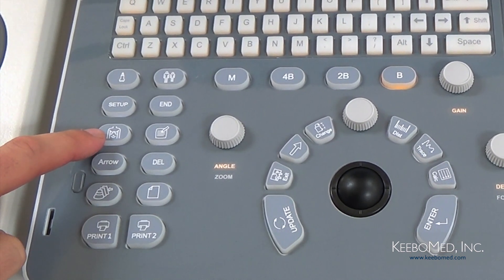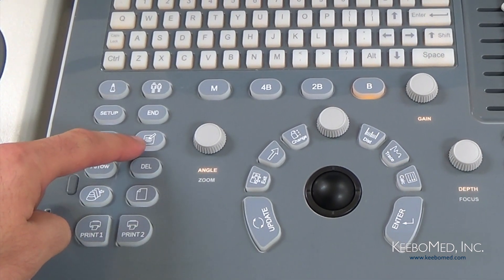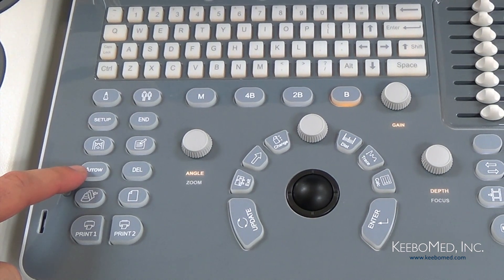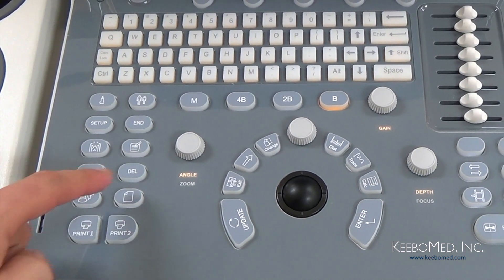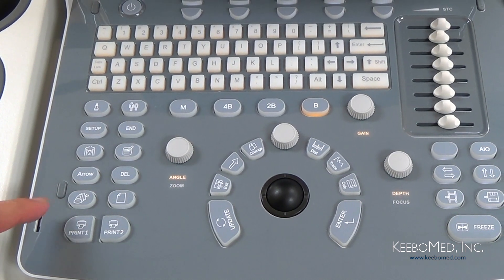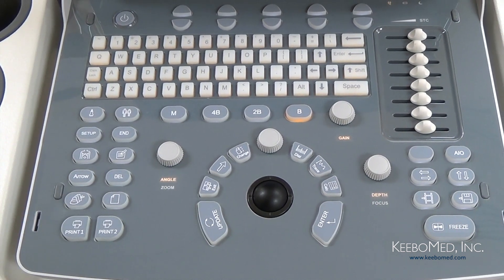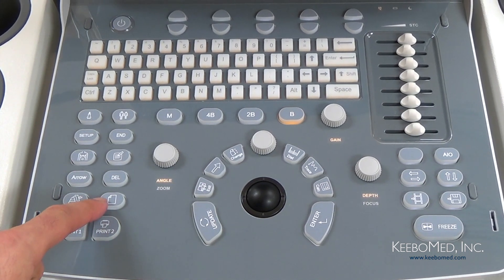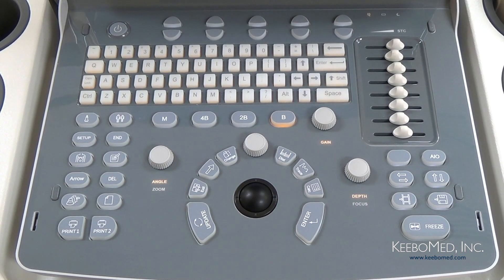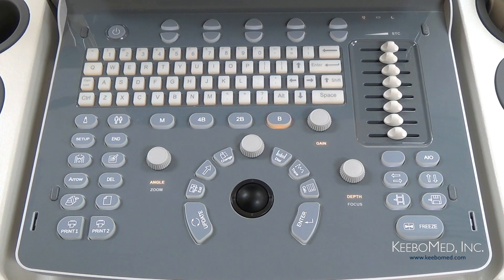Then we have the Body Mark key, which is used when an image is frozen and allows selecting specific body marks. This key is for Comments, allowing you to enter comments on an image. Next is the Arrow key, which adds arrows to an image wherever needed. Then the Delete key, which clears measurement lines, body marks, and comments. This key is for the Archives — it accesses the file management system where patient data can be viewed and edited. Next to that is the Report key, which allows you to produce, save, or recall an examination report. And finally there are two Print keys which allow multiple printers to be used to print reports or images.